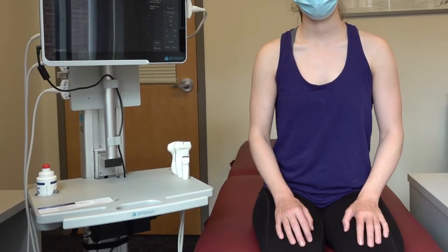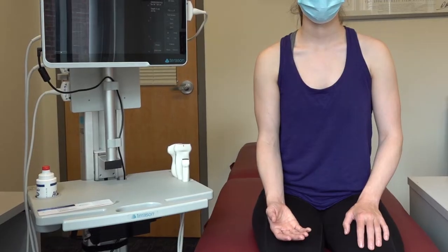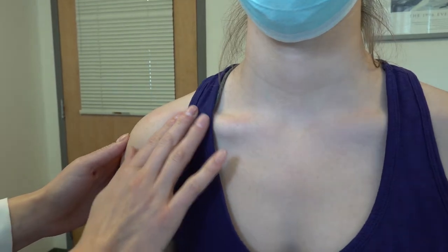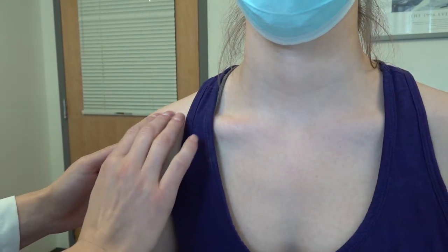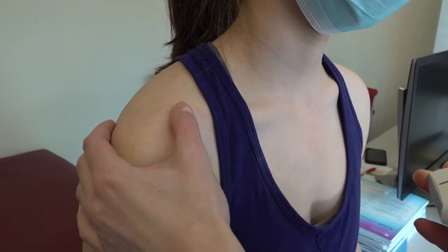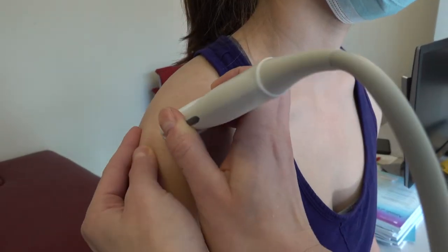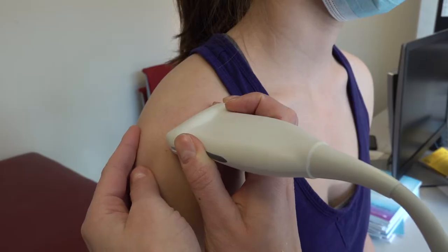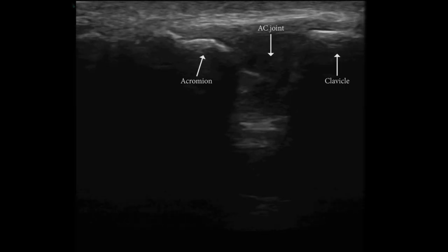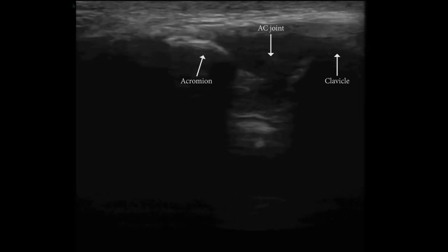Begin the exam with the patient sitting with their symptomatic arm in a position of comfort. Palpate laterally along the patient's clavicle until you locate the acromioclavicular, or AC joint. Place the probe, oriented with the marker facing the patient's right, at this location to visualize the AC joint, which normally appears as a V-shaped hypoechoic to anechoic area.